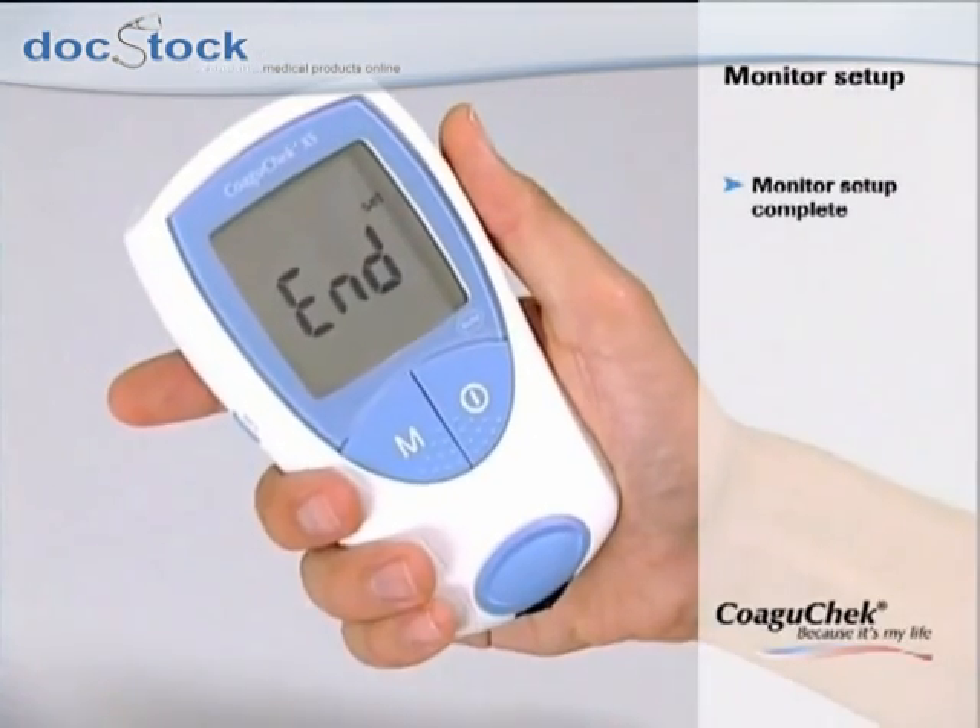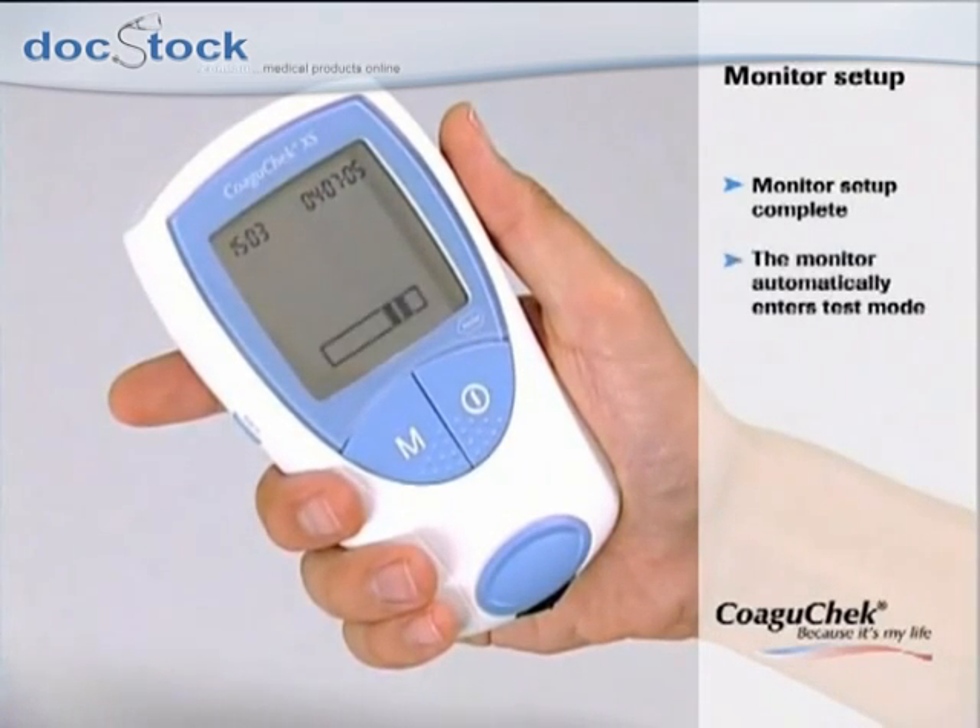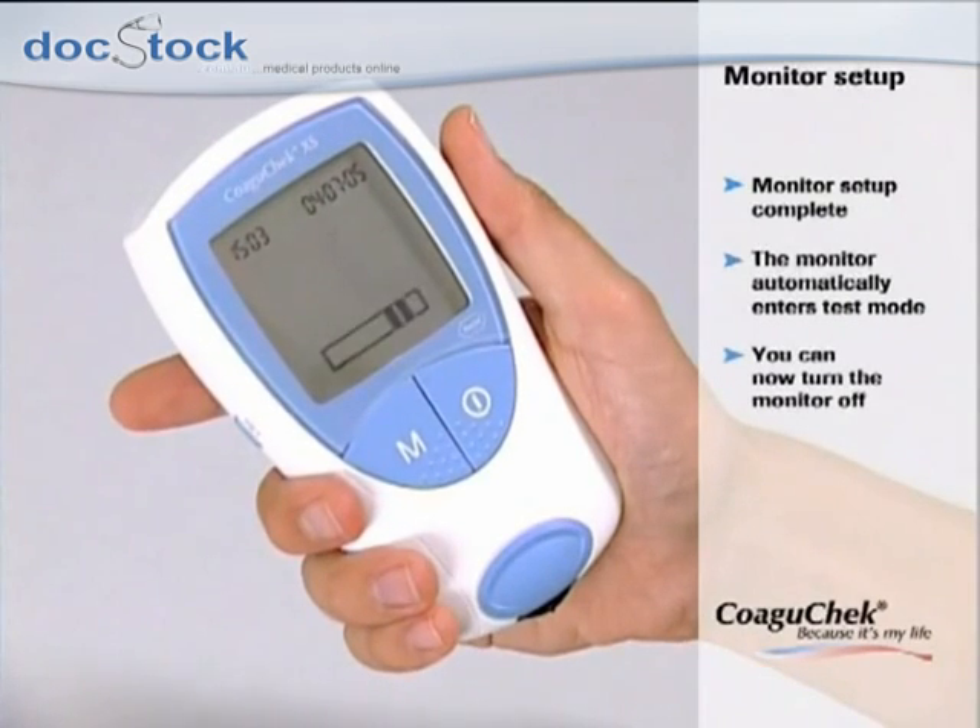As you can see on the display, the setup procedure is now complete and the monitor automatically enters test mode. If you don't want to proceed with testing, you can now turn the monitor off.